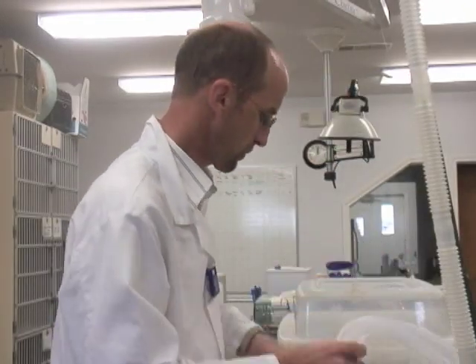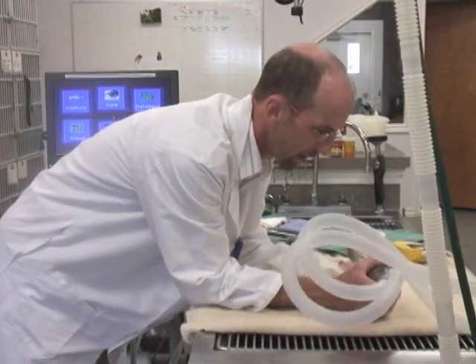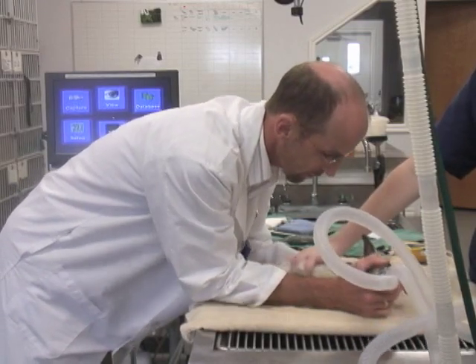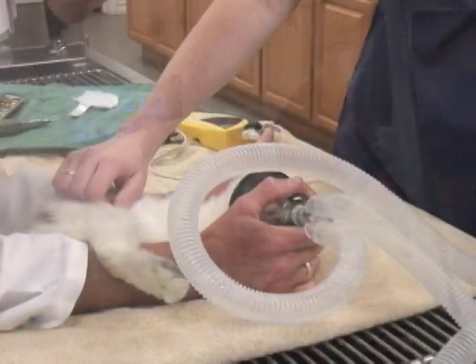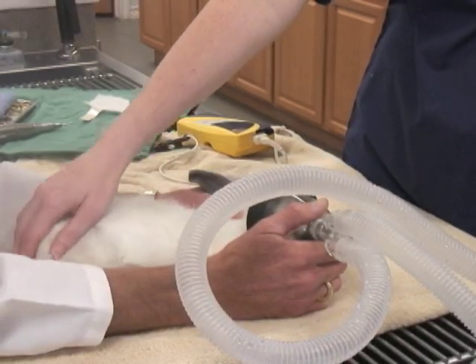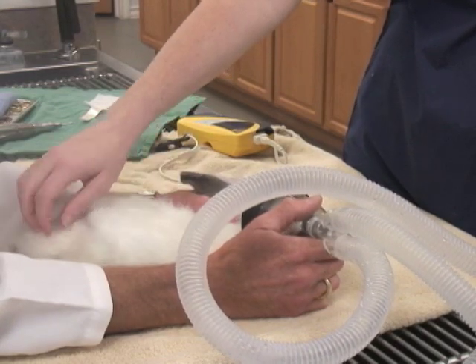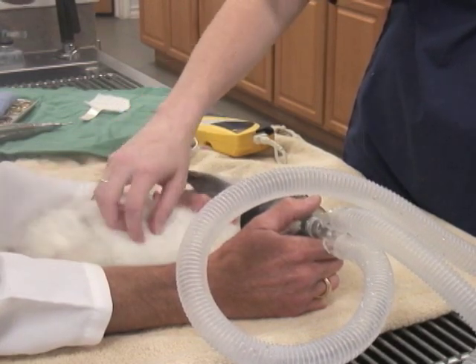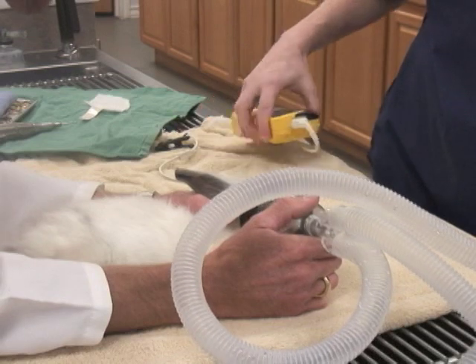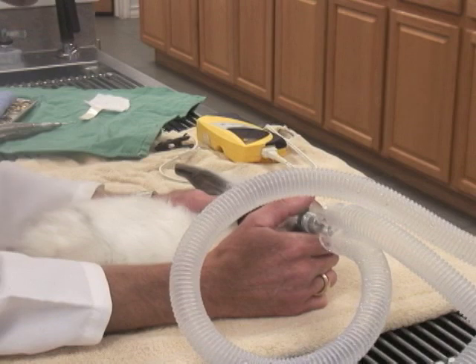We're going to take her out of the box and put the mask on — just trying to calm her down. Because they will struggle, as we saw her struggle when we first took her out, it's almost impossible when they're fully awake to get them to take the mask. So the box is a nice way where they don't feel threatened and can get a little more groggy from the gas before we put this mask on. Otherwise, we'd really have to hold her and she'd fight the mask a lot more than she does when she's almost asleep.